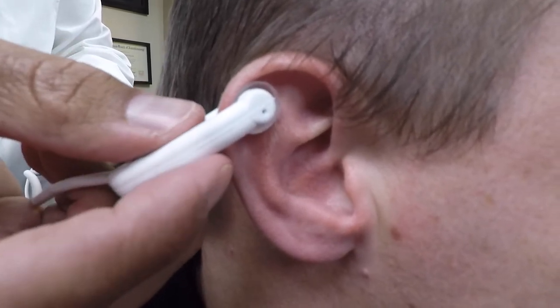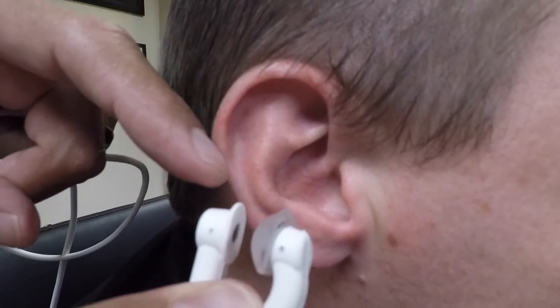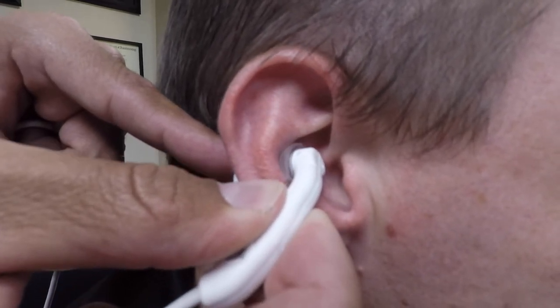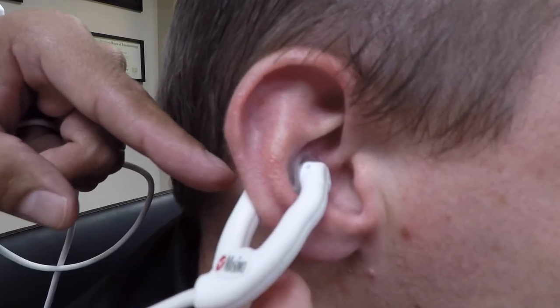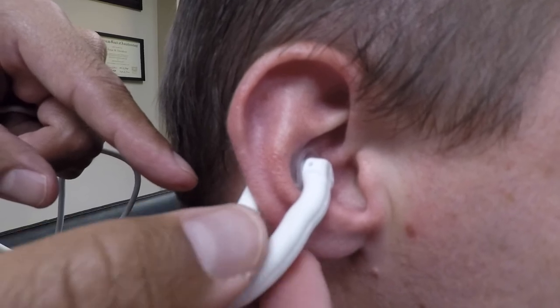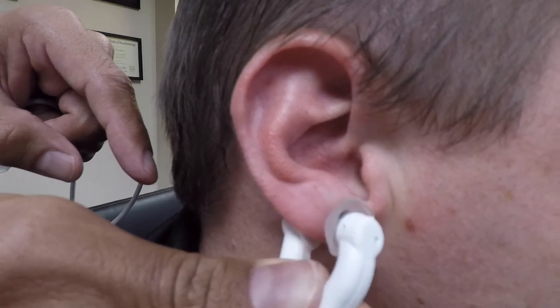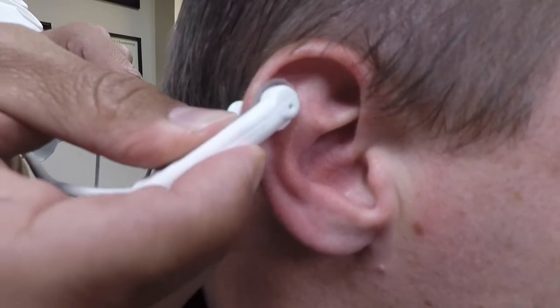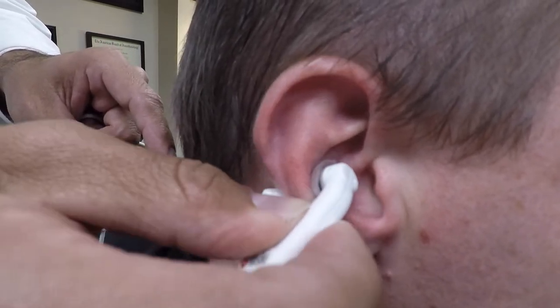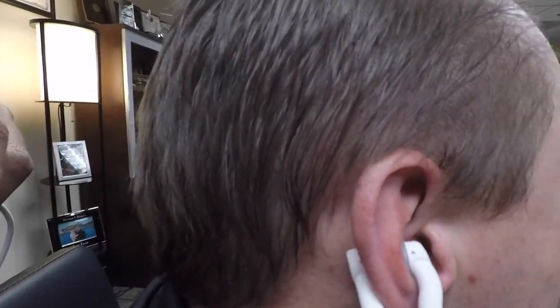The proper placement of the ear probe is with the rubber component going inside the ear just like that, so it's comfortable on the patient. It can then use the tissue through the cartilage on the inner portion of the ear. So this is the correct placement — incorrect placement on the lobe, incorrect placement on the outer ear. Correct placement has the plastic part going inside the ear. It should fit just like that.